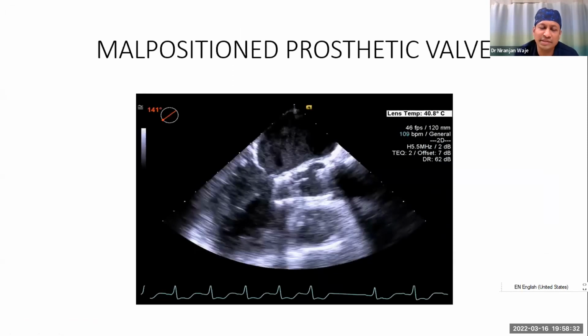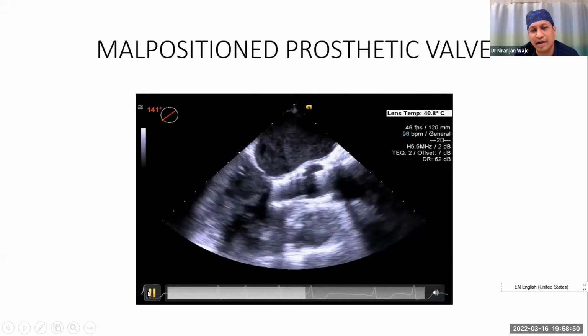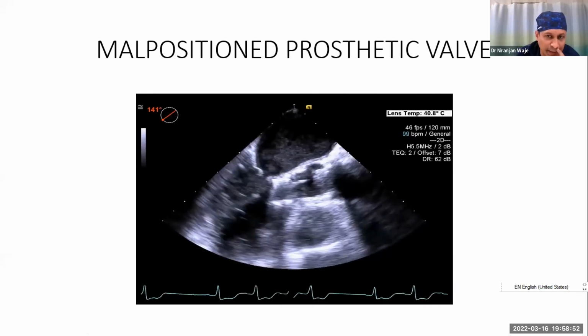So this can be a common scenario of pulmonary embolism, even while general anesthesiologists are managing cases, probably orthopedic cases, where they can land up in such a situation, and echo can be of help. This is another situation, a cardiac surgical patient, who after coming off bypass and coming into ICU had a hemodynamic instability situation.